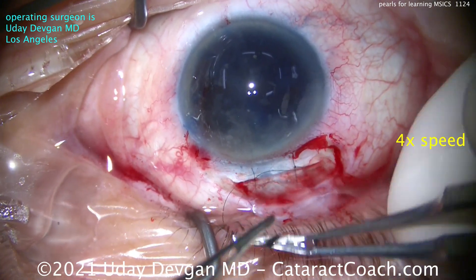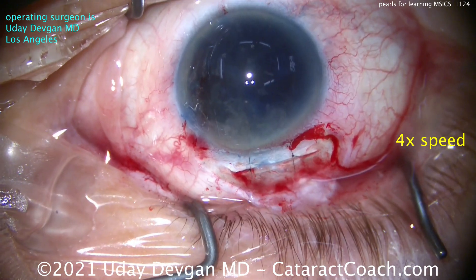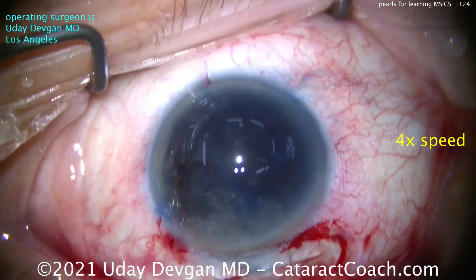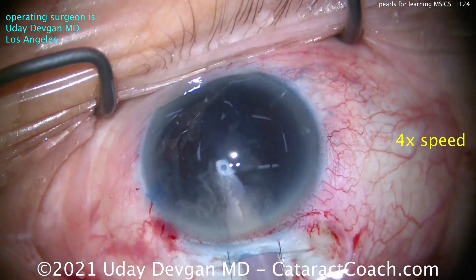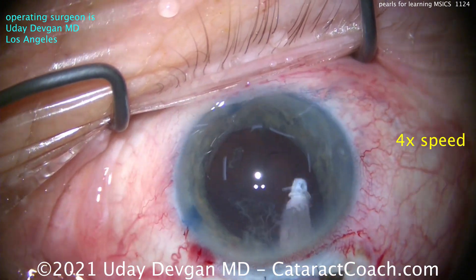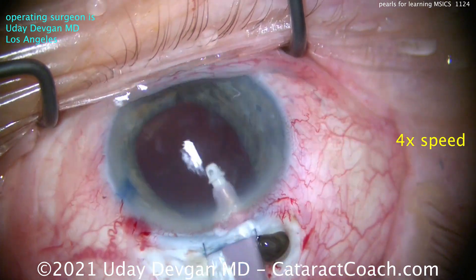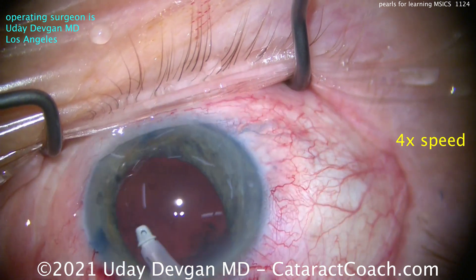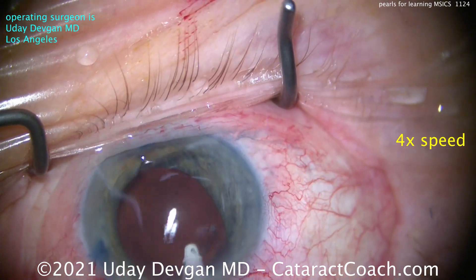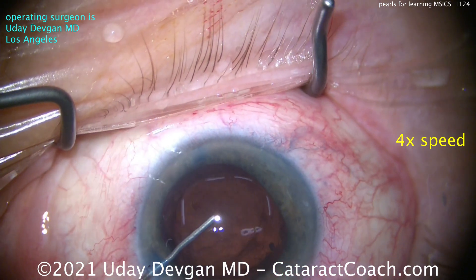In countries like India, surgeons do a thousand or more MSICS per year. Here in the U.S. I do a small fraction of that. With the two sutures placed, I go in with the I/A probe — the incision stays shut — and clean out any remaining cortex and lens material. There's a little iris prolapse at the side incision, which you can fix by lowering infusion pressure, but it's of no consequence. We've cleaned everything up.